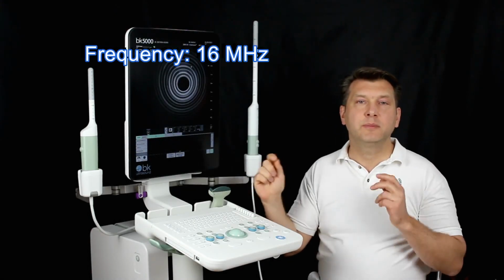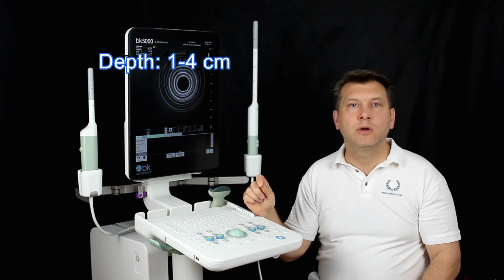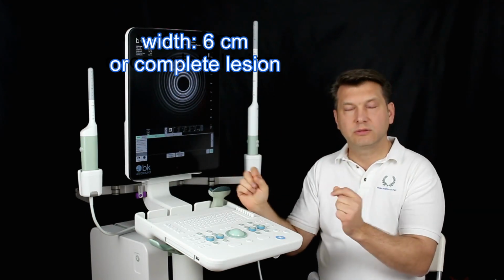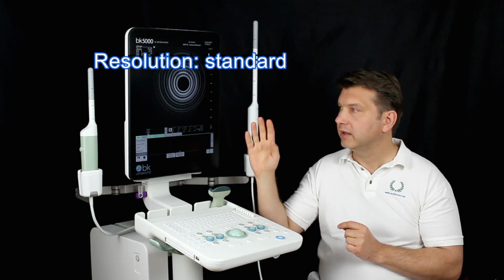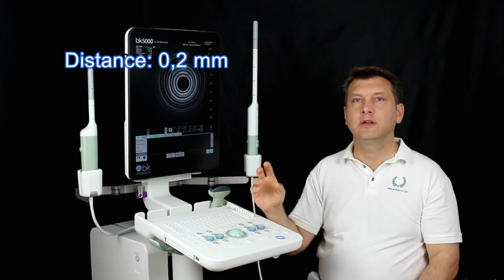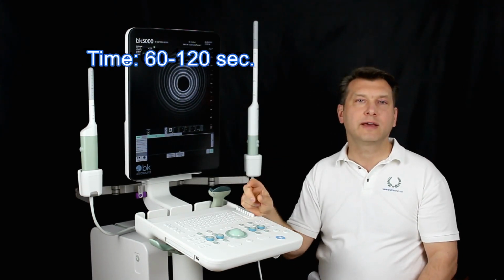Frequency 16 MHz, depth 1 to 4 cm, width if possible 6 cm or complete lesion. Resolution in this scanner maintained in standard settings, distance 0.2 mm as low as possible, time 60 to 120 seconds.